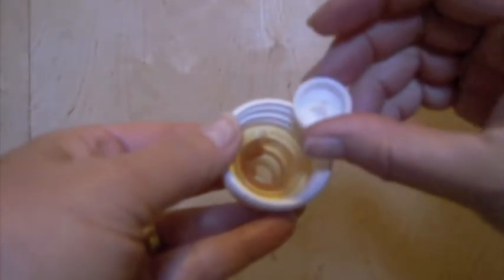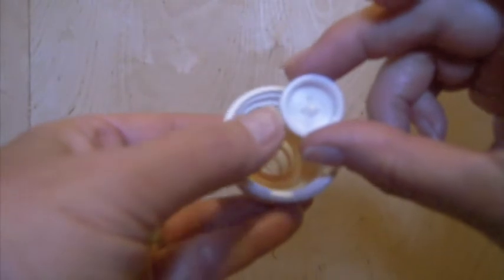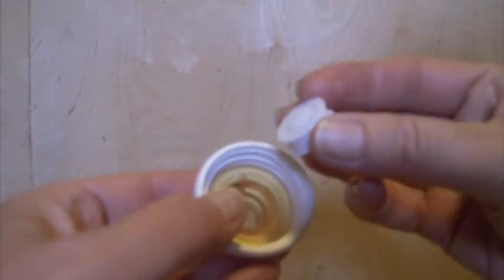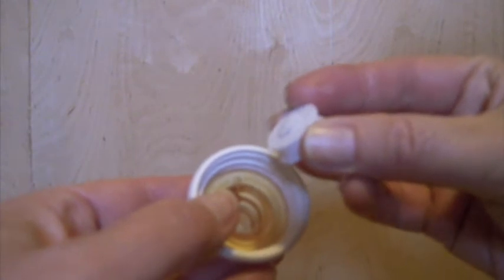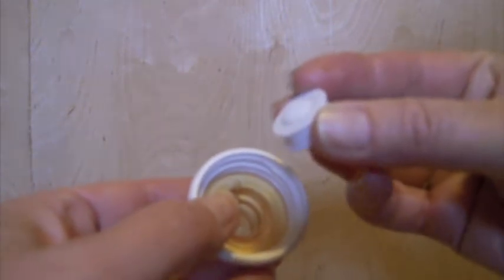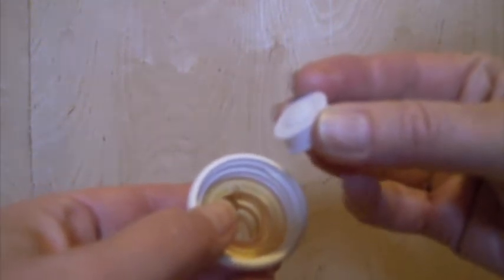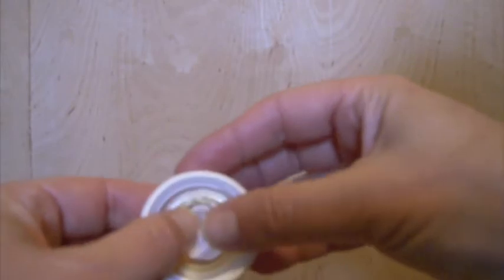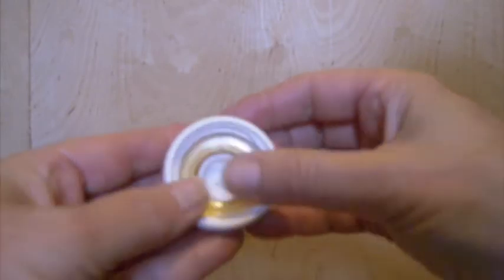Then you're going to insert the valve. If you look on one side, there's a point. If you look on the other side, it looks flat — but when you poke that little point, you'll see that it opens. It's a one-way valve, and the opening — the flat side — goes into the nipple and is pressed down with your thumbs.